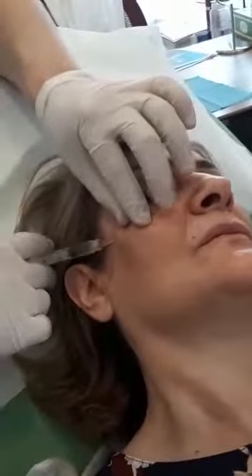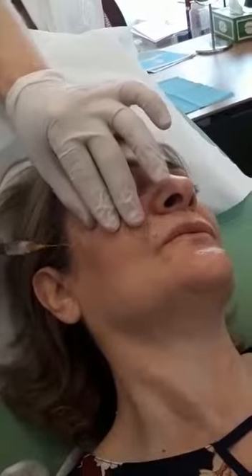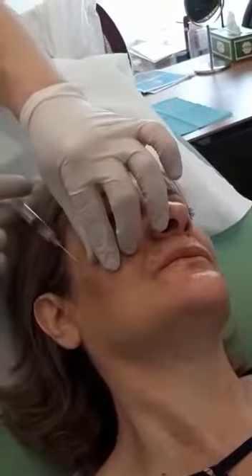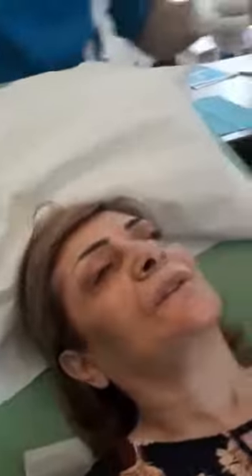Very good, madam. Okay. Now I'm going to skip the other side. We will use this. Yes, I'll show you now the thread. It's 7 centimeter. Yes, make it just empty here.